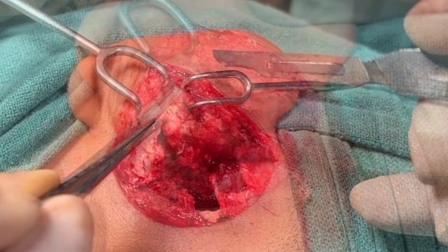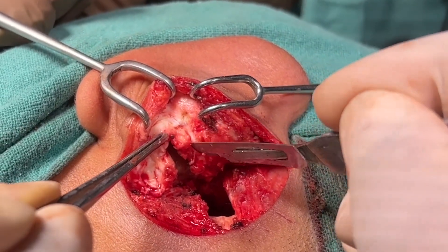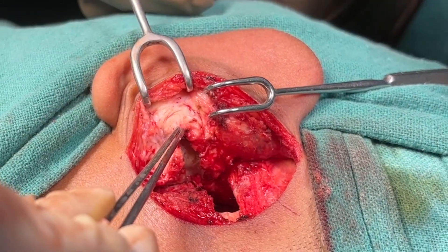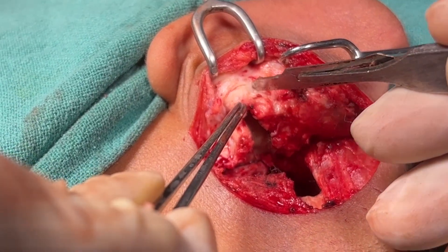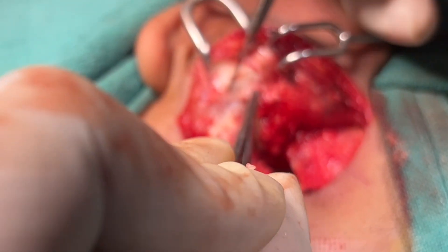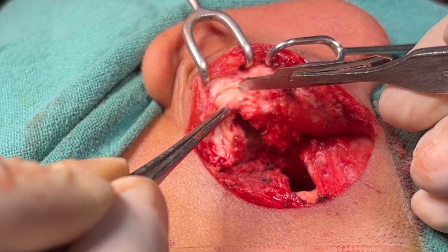I am using a number 15 blade and giving an incision in the concheal cartilage partially, not in full thickness. To prevent injury to the skin, you can rotate the number 15 blade upside down and use the beveled end of the knife to cut the remaining part of the cartilage. This technique prevents injury to the skin.